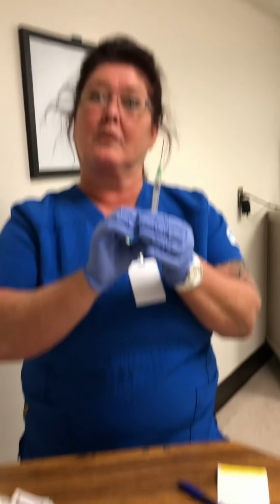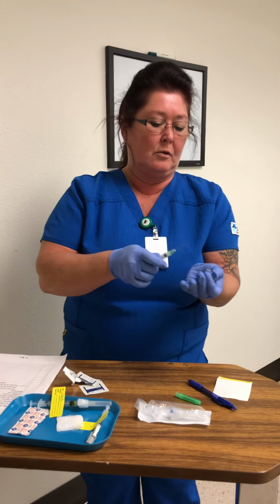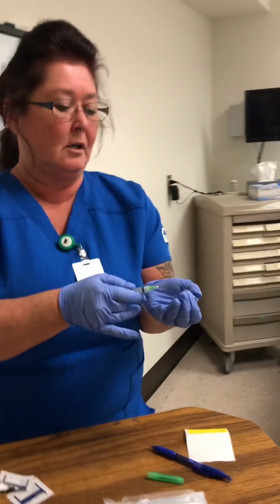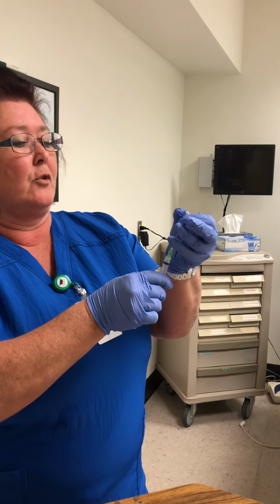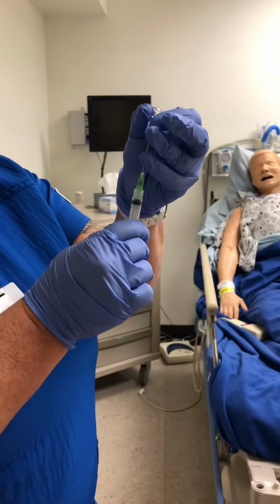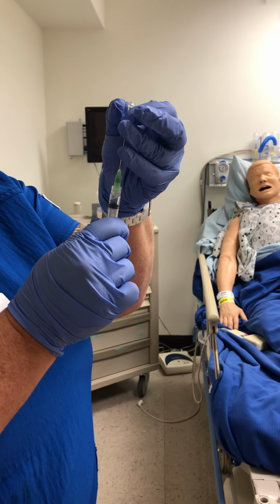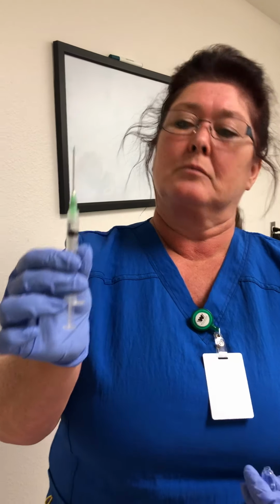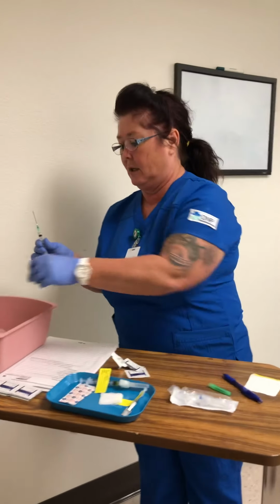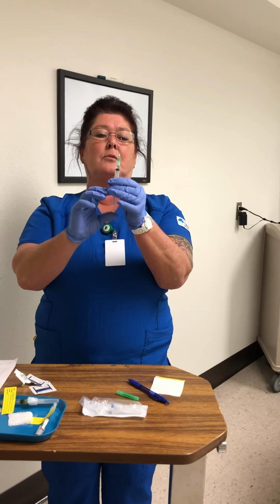No, actually I'm not. No air goes into this one. So this one I'm going to turn upside down. And I'm going to draw out my 1/2 mil. And then this I would discard in the sharps container. I am going to make sure there's no air bubbles.